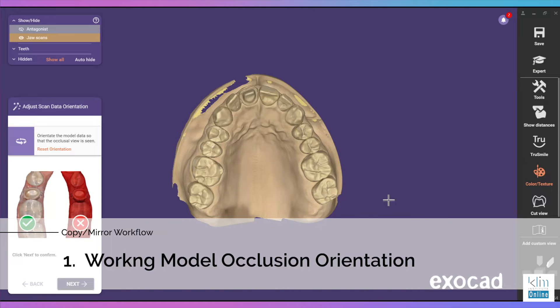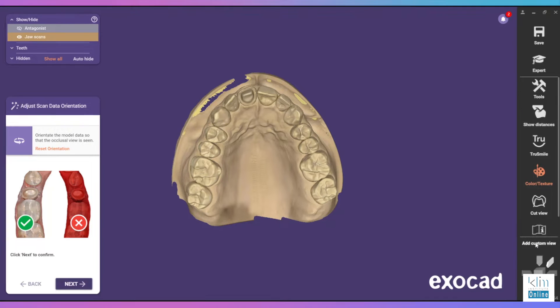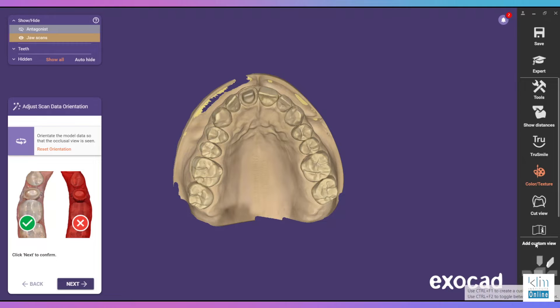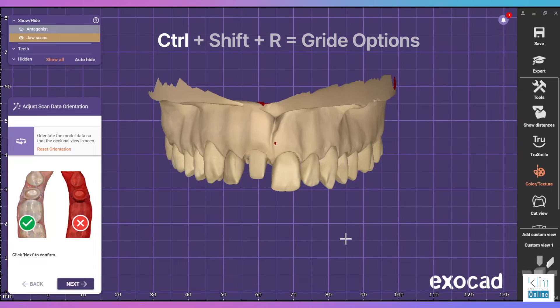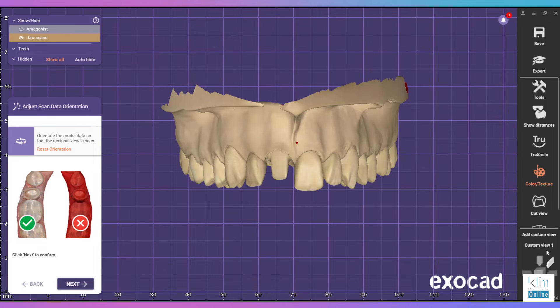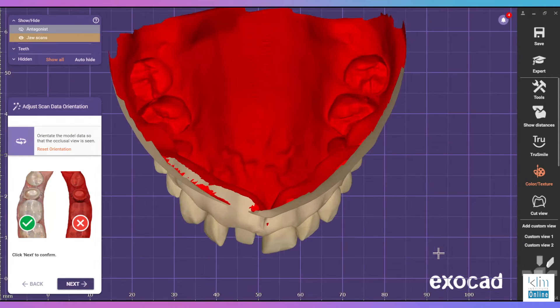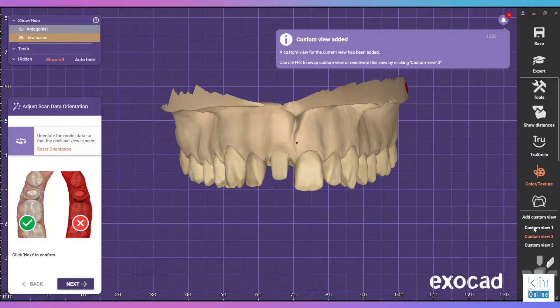Critical step: orientate the model to the occlusal view of your working model, and while you're there turn on and add a custom view for that occlusal table. One thing nice about ExoCAD is Control+Shift+R turns on the grid. You can toggle through different grid options, set up your occlusal plane and your smile plane, and any other views that will assist during the design process — that makes setting the model or design really nice for future steps.